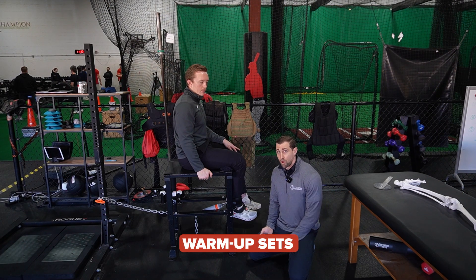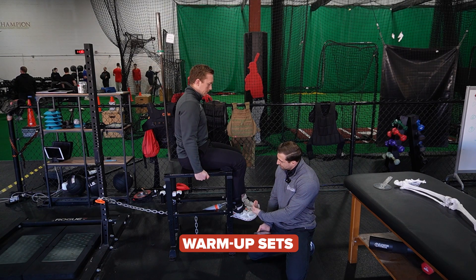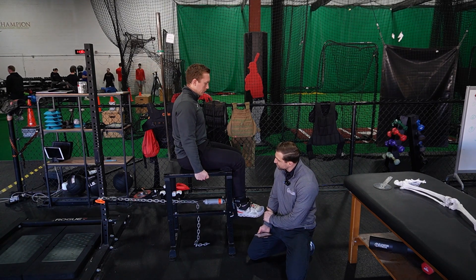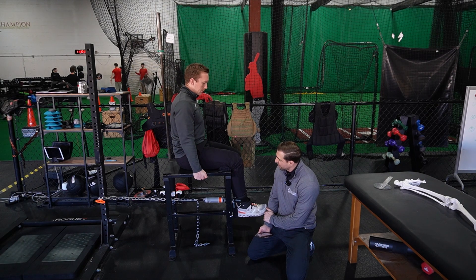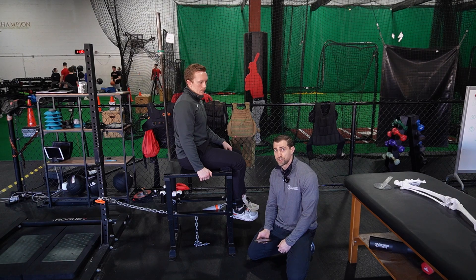You also want to give your athletes a little bit of a warmup — maybe one or two repetitions where they're slowly pressing into the resistance. Then ramp up to maybe 50% of max, 75% of max, make sure everything feels okay. And obviously if there's any sharp pain that day, you probably don't want to push through that.